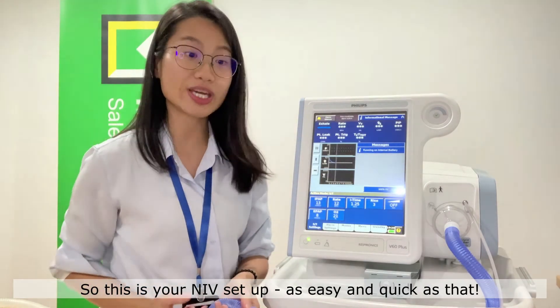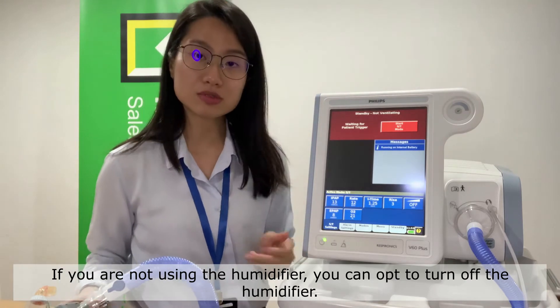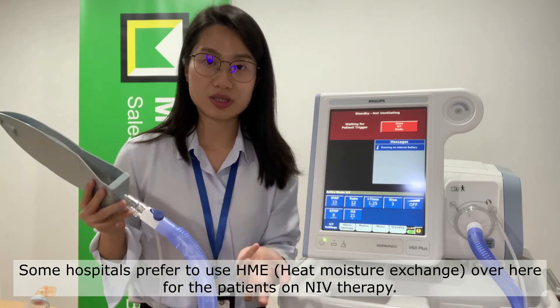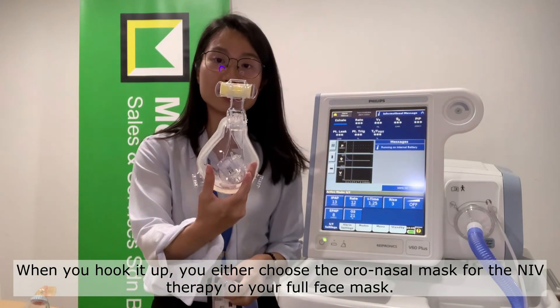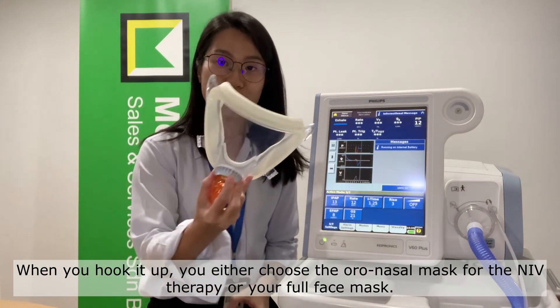As easy and quick as that. If you are not using a humidifier, you can opt to turn the humidifier off, because some hospitals prefer to just use an HME for NIV therapy patients. When you hook it up, you can either choose your oral nasal mask for NIV therapy or your full face mask. Thank you very much.